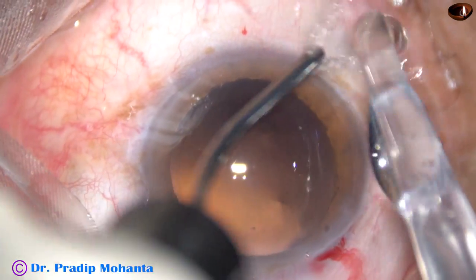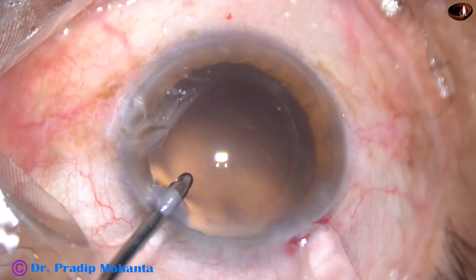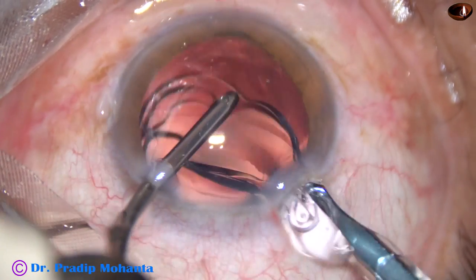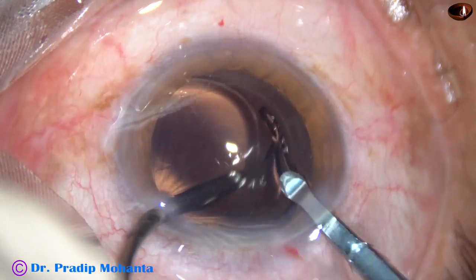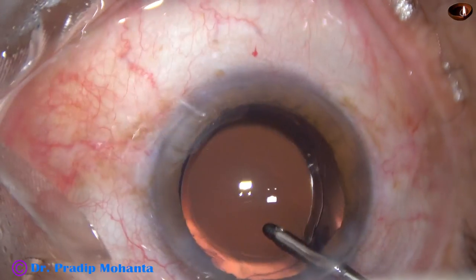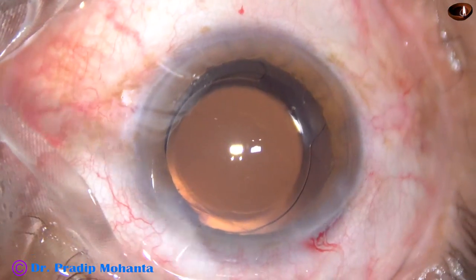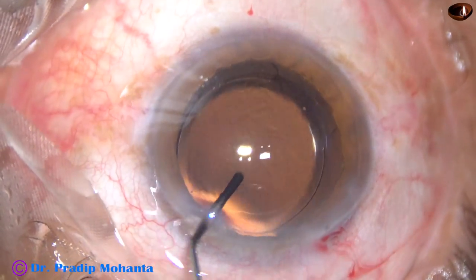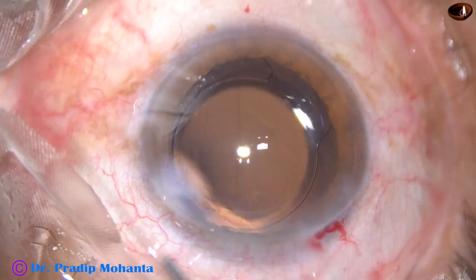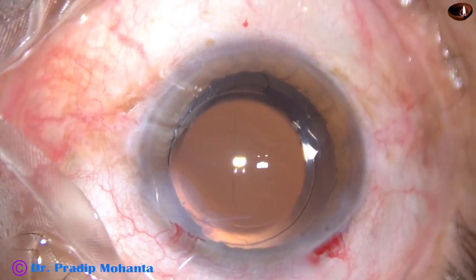And this is hydro implantation. The anterior chamber is kept formed by the irrigating probe. In this case, this is a monofocal single-piece intraocular lens being implanted in the capsular bag. The lens is dialed by the irrigating probe itself. Now this is a bit of moxifloxacin. The single side port is closed by hydrating corneal stroma on either side of this stab wound.